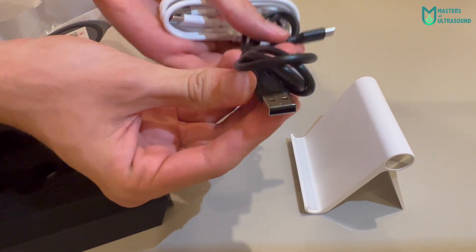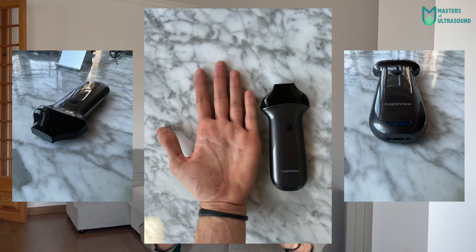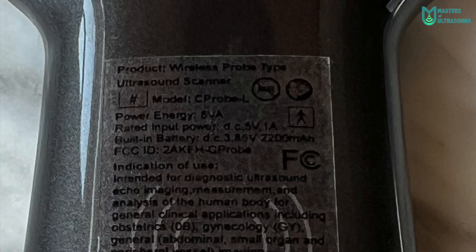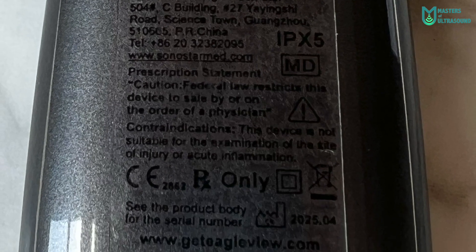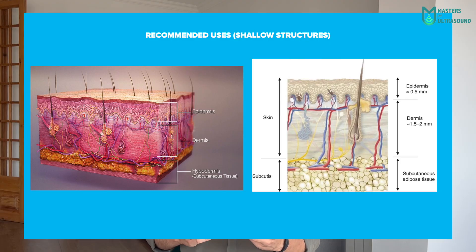I imagine one adapter is for the wireless charger and the other is to charge the probe itself directly. It's very light — only 160 grams or 0.35 pounds — and so small that it fits in every pocket, at just 15 x 6 x 2 cm with a probe footprint of 24 mm. Waterproof IPX5, it has a 192-element linear probe able to reach a frequency range of 16 to 20 MHz, specifically designed for very shallow structures from 1 cm up to 4 cm.